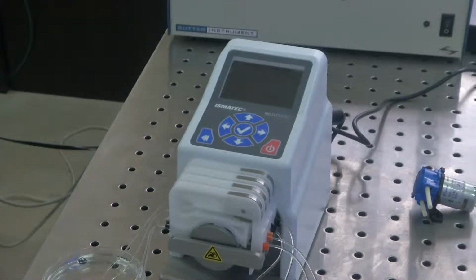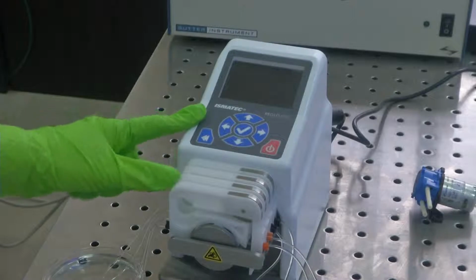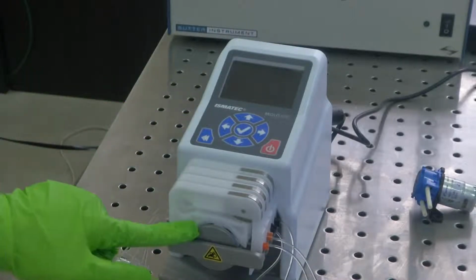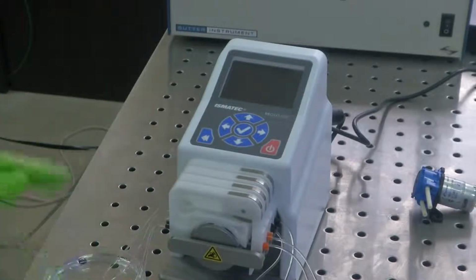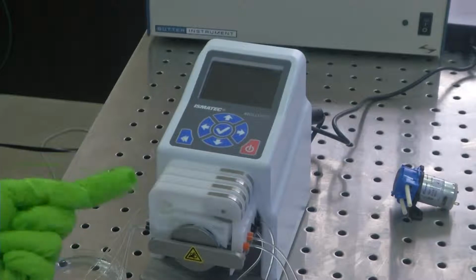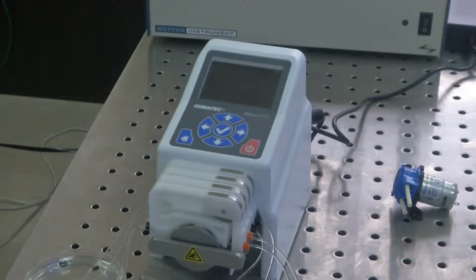We'll look into the different parts of the pump and see how we could operate them. The peristaltic pump we have here is also called the roller pump, because there are rollers inside which put force on your tube, and then the driving mechanism happens.